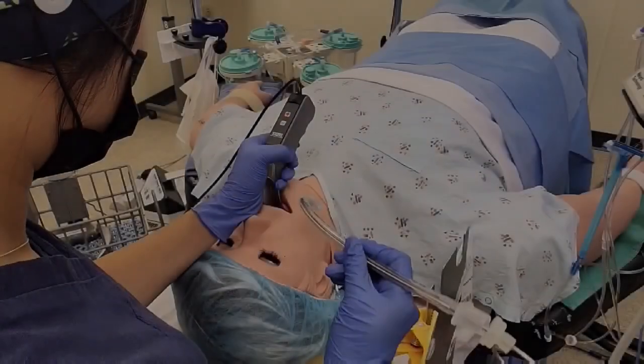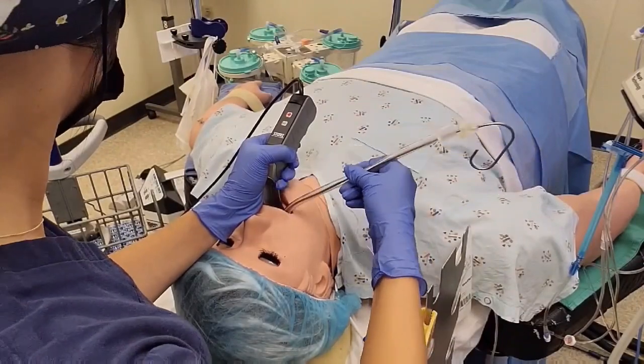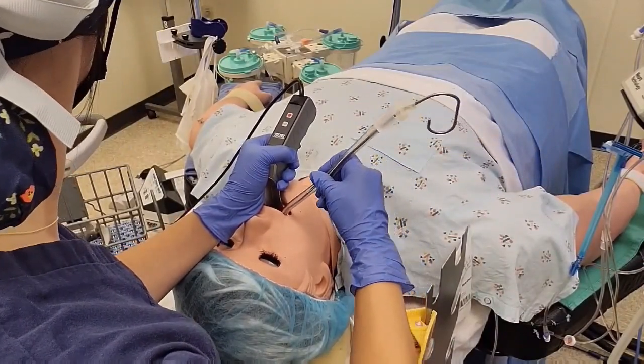Here I am entering my blade at a 45 degree angle and pushing the tip into the vallecula to lift the epiglottis. I introduce the tube from the horizontal plane and once the tip of the endotracheal tube is in between the vocal cords, I advance the tube into the trachea.